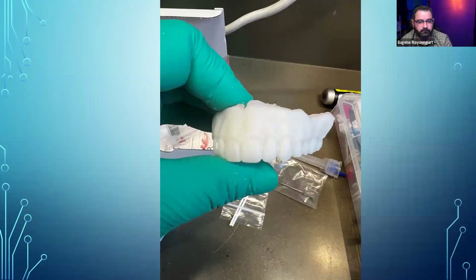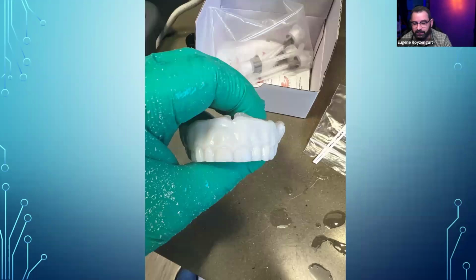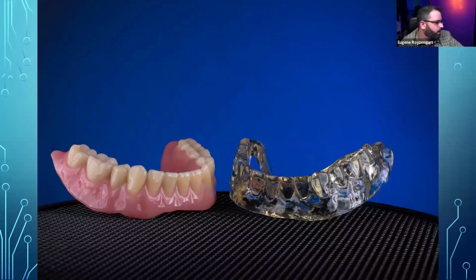Okay. So this is what it looked like for the reline. Look how much I had to reduce on the teeth. I mean, this is just crazy how much work we had to do. Okay. So it kind of looked like this. Not great aesthetics, but something that he can wear until we get things lined up. Okay. Hope it makes sense. Next thing I want to show you guys is surgical guides.